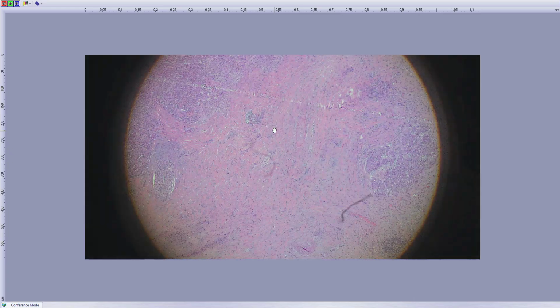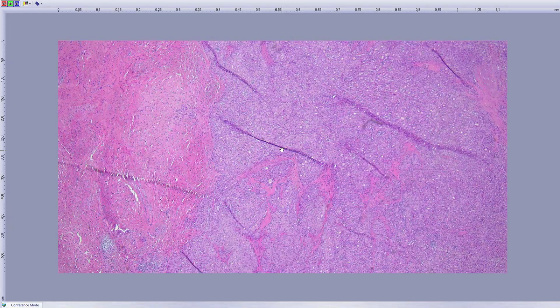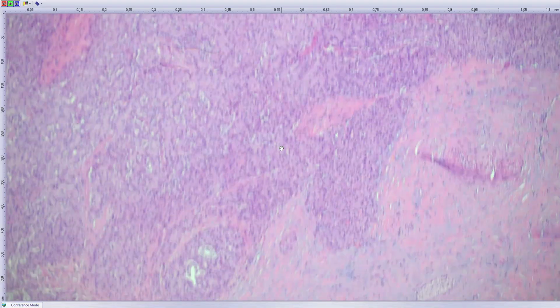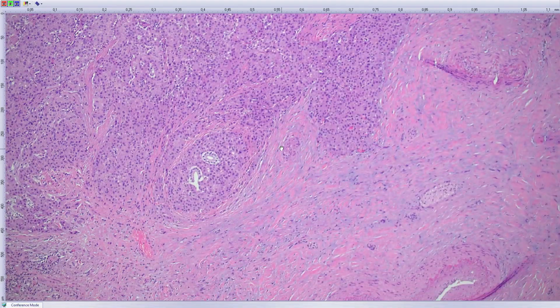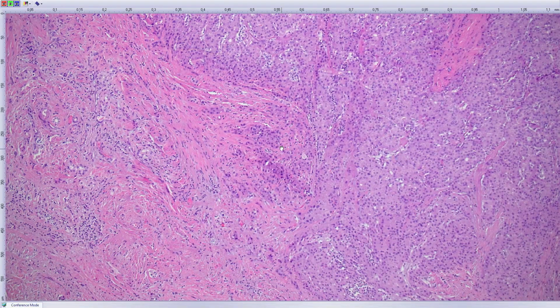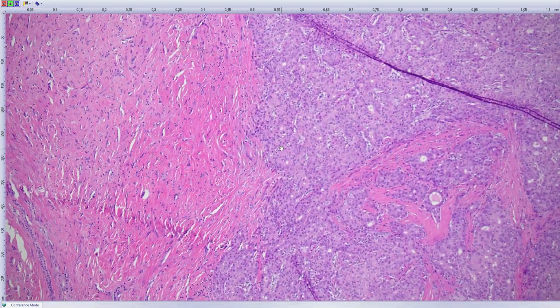Now I have lesions of liver, quite a large lesion of liver, and you can see this dominant thing, the basophilic tumor. There are infiltrative borders, and I think it very clearly qualifies for infiltration of a carcinoma, so the hepatocellular carcinoma.